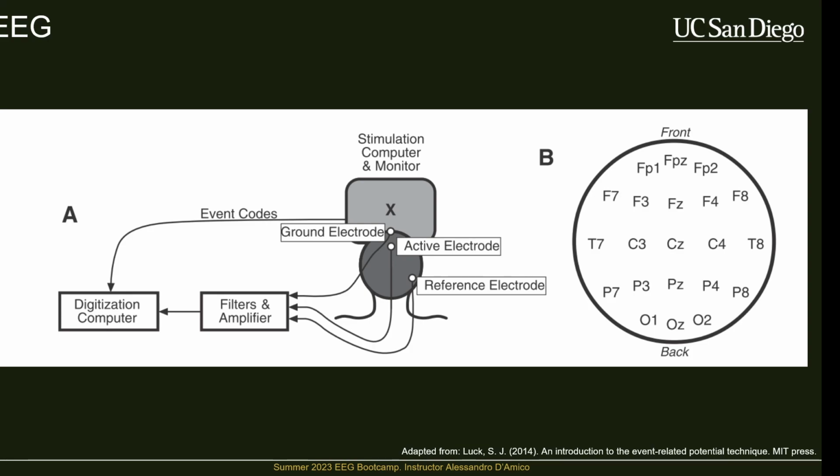Yeah. It's a brilliant question. So just to repeat for the recording, the question is essentially, what's the upper limit on our sampling of this activity? We have two different sampling rates in play here. We have how quickly the computer and amplifier are able to poll for the EEG, right? So how quickly am I getting new signals from the EEG versus how quickly are we showing new stimuli on the monitor, or even recording somebody's inputs and stuff. The reason I love this question so much is that I'm a huge nerd and fan of synchronization, and most people don't care enough about this.